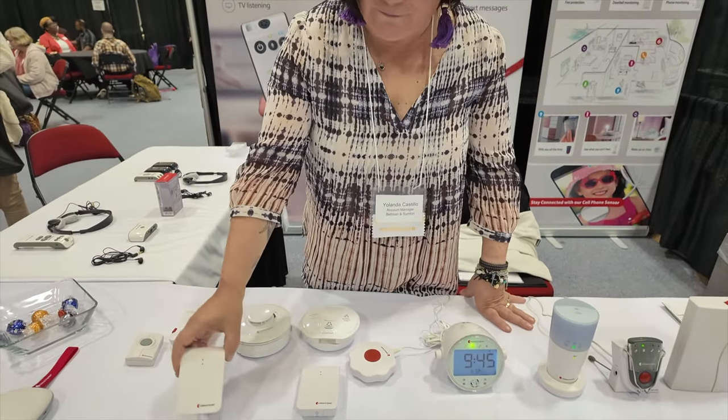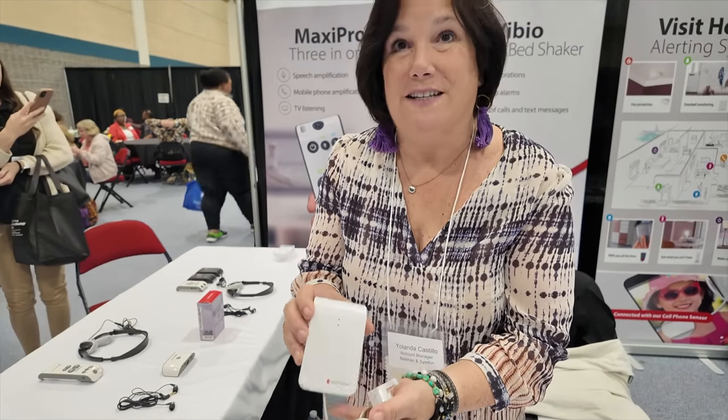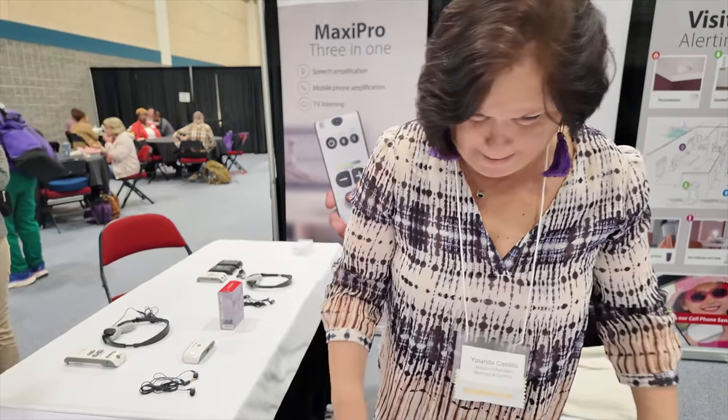If they have a telephone landline, they can use this device to connect their phone, and they will also be notified the same way. If they have an incoming call, it would do the same type of vibration patterns.